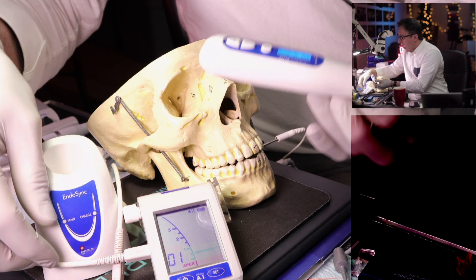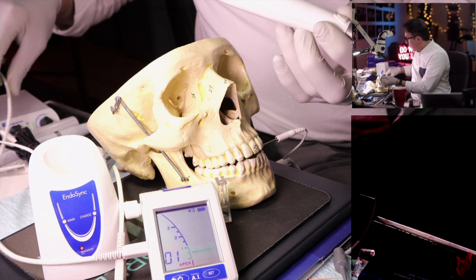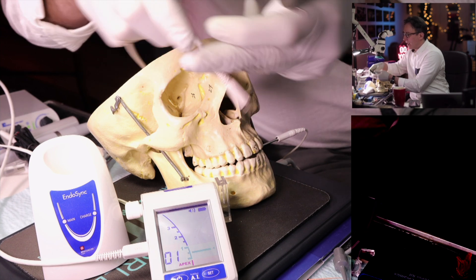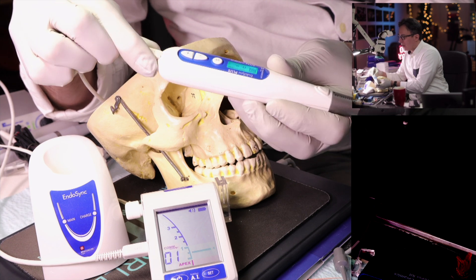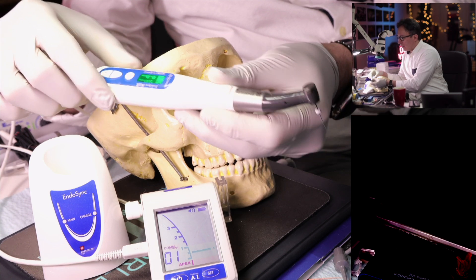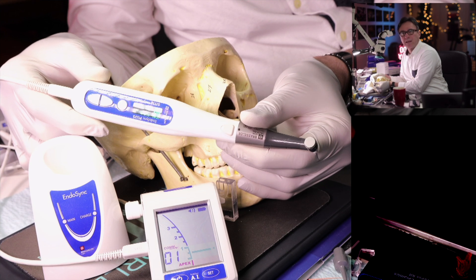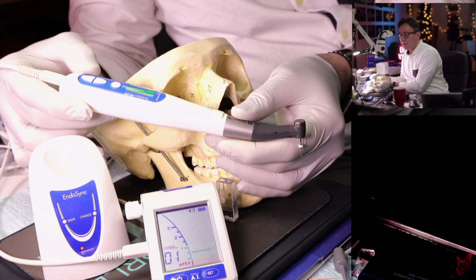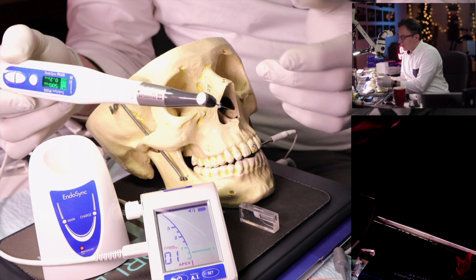For the combination of Endosync and Endosync AI, you need an additional cord that connects the two. It connects from the back of the handpiece, and now you have the apex locator connected to the handpiece. There are several memory settings on this — I've programmed them to reflect different instruments used with the Endosequence line.